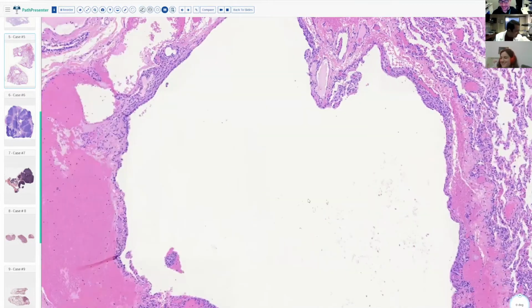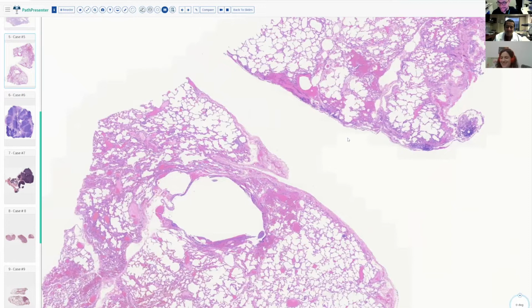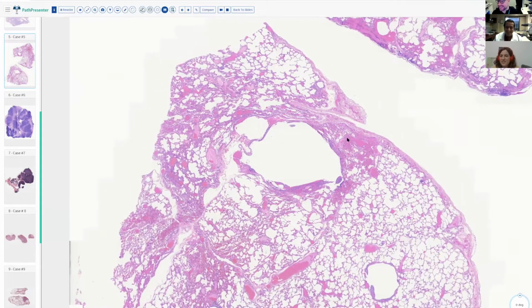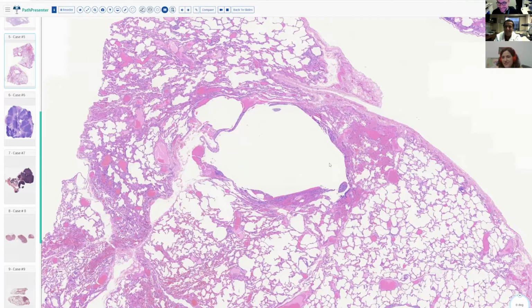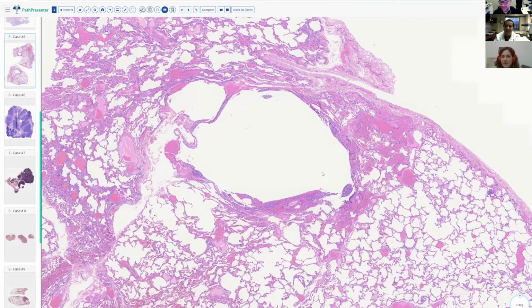Yes. So this is a classic case of LAM, or lymphangioleiomyomatosis, which is a bit of a mouthful, which is why we just say LAM. Tongue twister, yeah. When I was first a resident learning about this, I just heard everyone say LAM, and I thought it was lamb, so I kept Googling for lamb in the lung, like the animal, and I realized that the B is not actually in the name. So for all the trainees out there, it's just LAM. There's no B. Pulmonary pathology is like a crossword or a letter soup. We talk like that, LAM, UIP, NSIP, and people are like, what are you talking about? Yeah, it's an alphabet soup of things.